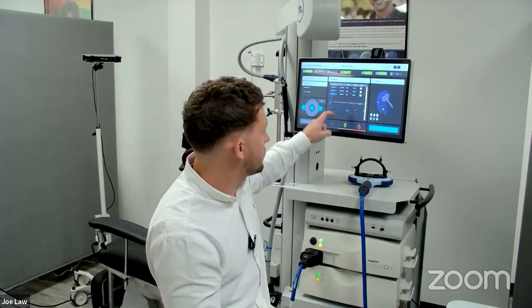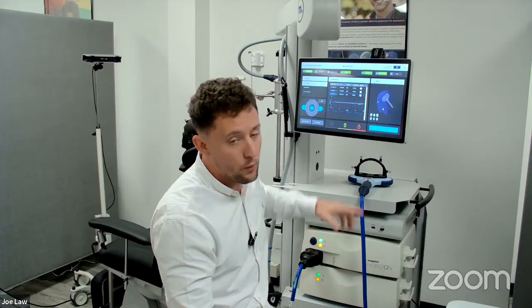And not only will you get a visual response, but you will also then see a nice sine wave on that waveform when you elicit a response and we get muscle signals. A benefit to that is what we've noticed is even when the thumb stops twitching, and that would usually be the dosage or the MT used to that patient, the EMG is still picking up muscle response, which allows you to bring that MT even further down, which allows for patient comfort. If you haven't got to treat the patient with such high dosage, it's going to be a lot more comfortable to do.